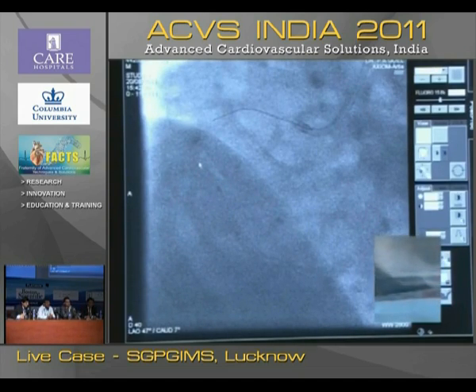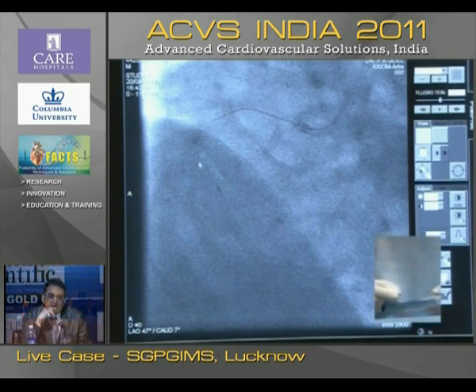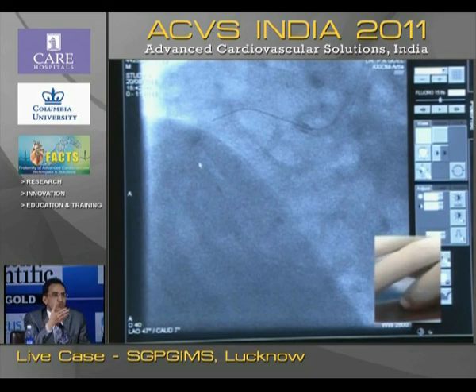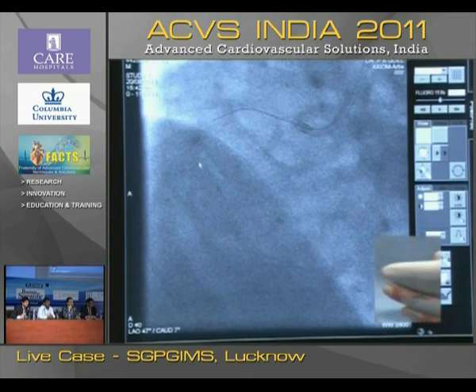I will not proceed with this. Let me have a micro catheter and a Fielder FC. Dr. Goel, you have got a good progression. What I have taken is a micro catheter now. Go ahead. He's got a good progression with Whisper, but it was coming back.